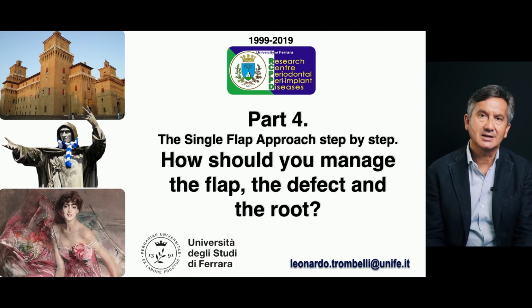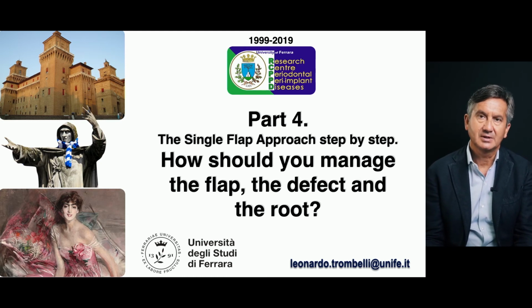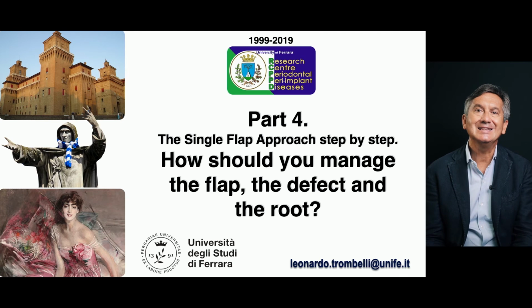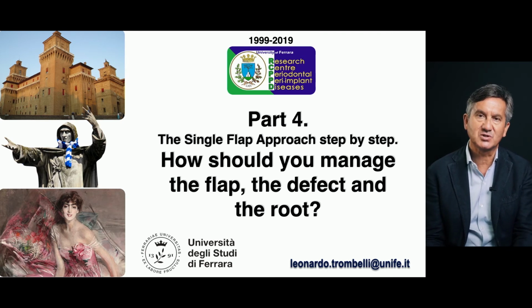These two parts are relevant because they are common to the procedure. In other words, they are independent from the fact that you are using a specific regenerative device.